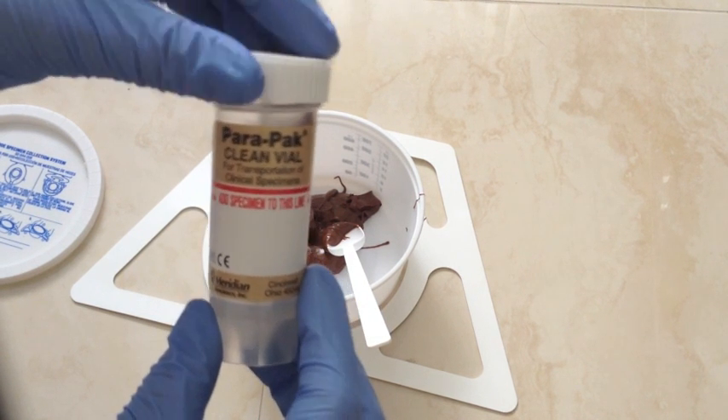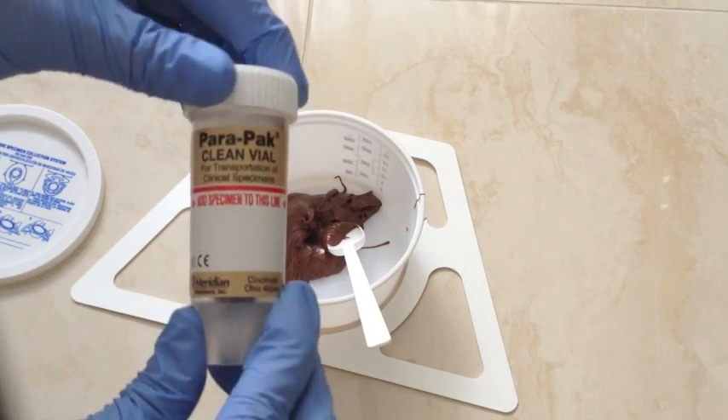In this video, I'll be showing you step-by-step how to collect a stool sample in the comfort of your own home.